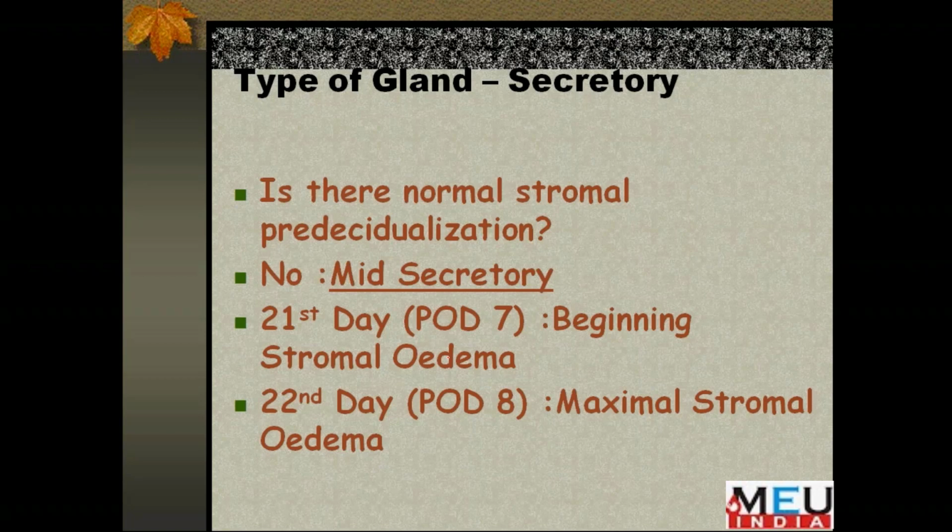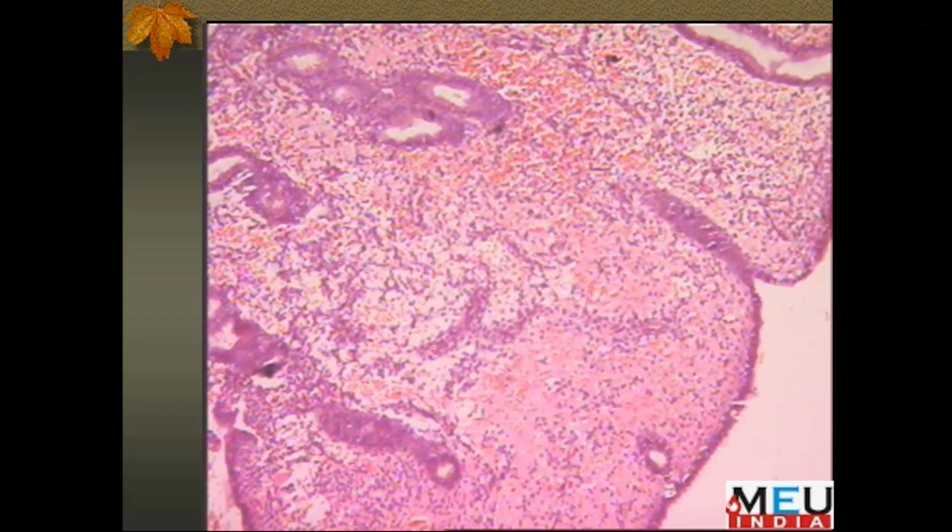the stroma becomes quite dense, and the perivascular cuff reaches its maximum, so much so that it starts pressing the capillaries, and these glands start merging with each other.